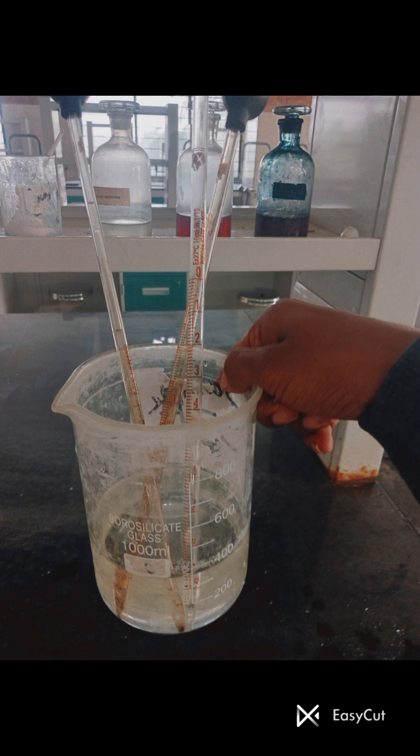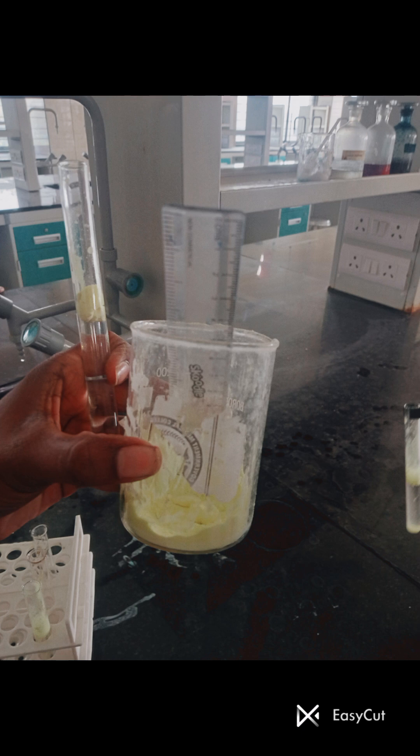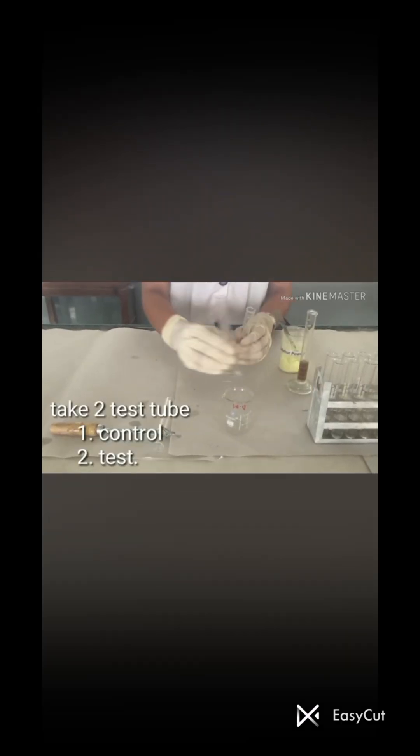For performing this test we need a urine sample — you can see this is the urine sample — and this is sulfur powder, yellow color. We also need distilled water and two test tubes. One test tube is used for the control and the other test tube is used for the test.